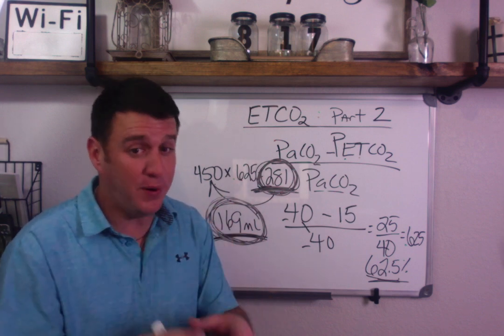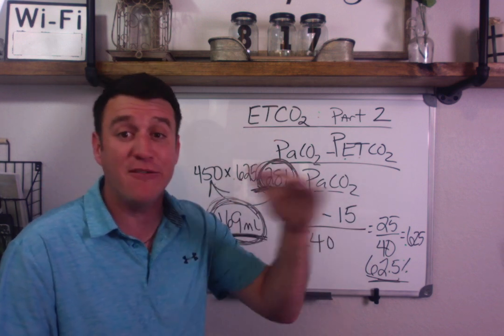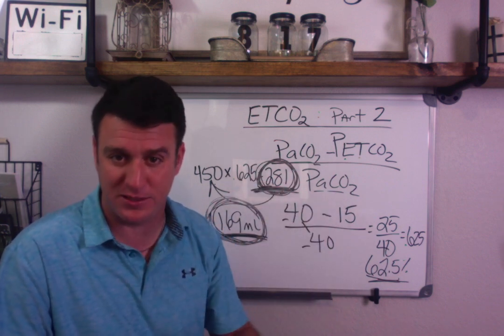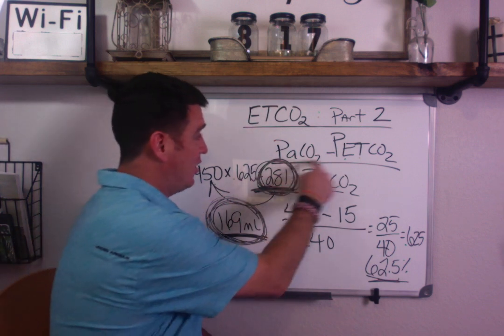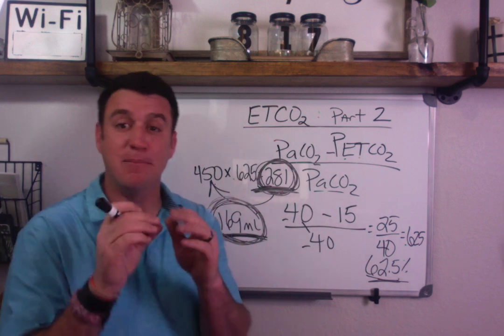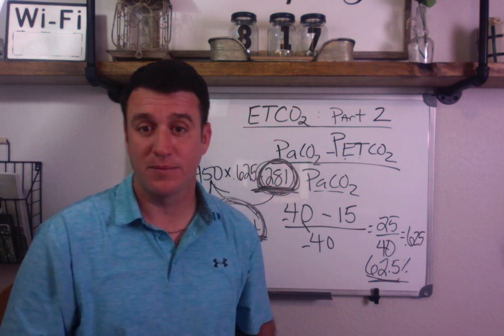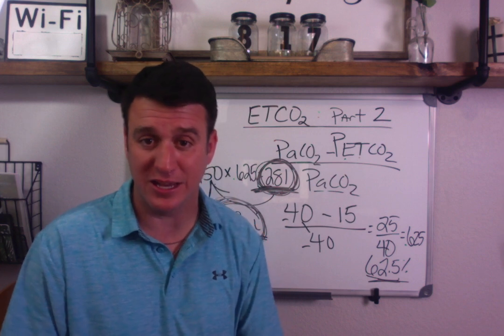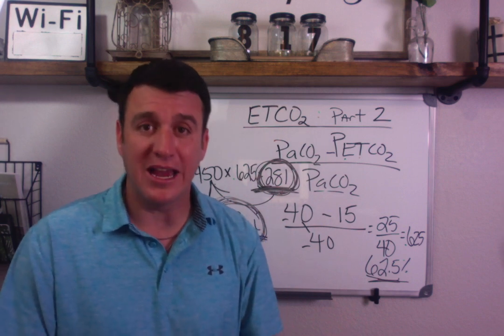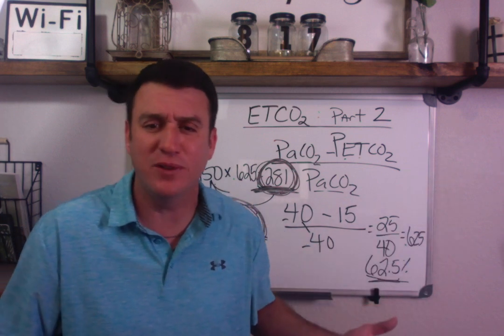Because see, when you put in 450 mLs, not all of it is participating with gas exchange because every patient you're taking care of has some element and some amount of dead space. So you can use this formula, PaCO2 minus PetCO2 over PaCO2, to assess the amount of dead space and the amount of tidal volume that you're losing with every single tidal volume. That's how you use end-tidal CO2 at the bedside to make better clinical decisions taking care of your patients without having to redraw blood gases every single 2 hours, make a change, draw a blood gas. No, we don't need to draw a blood gas.